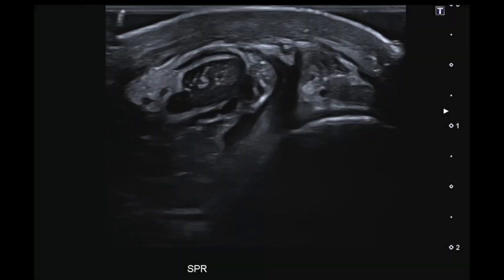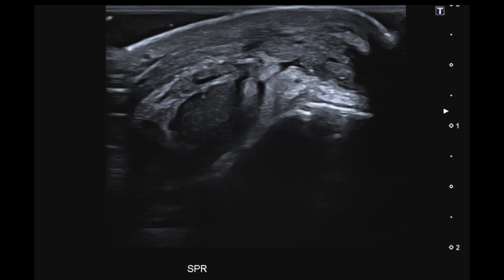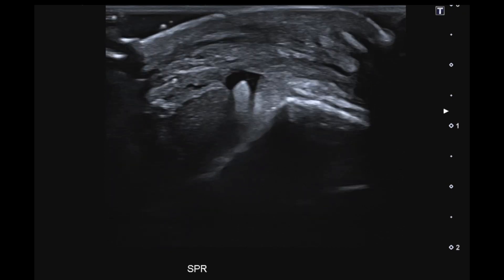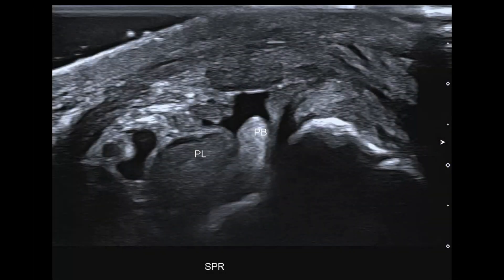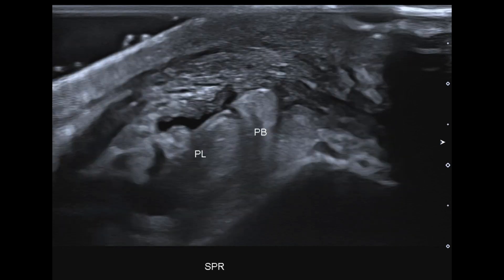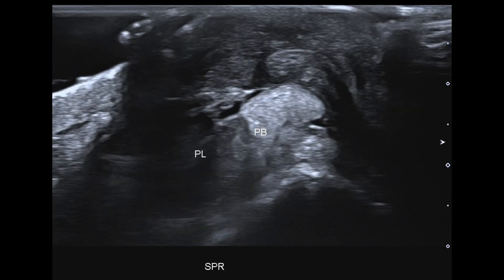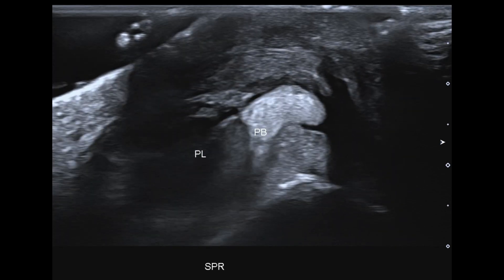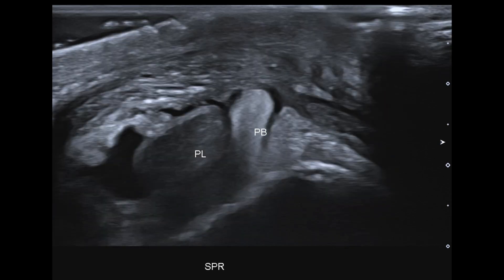In this example the SPR has been surgically repaired but has been re-injured. There appears to be some suture material present and a bony anchor noted. With dynamic movement we can see subluxation of peroneus brevis — note how echogenic and thickened this tendon is. It is a very unhappy tendon and won't be happy until the SPR is surgically repaired.